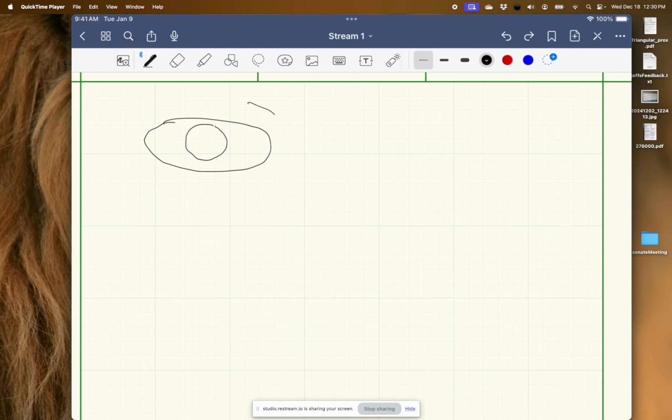There are going to be coils placed around this patient, and each of these coils is going to sense data from the patient from a disparate vantage point. So the patient we're going to represent as X. We're only going to be looking at a 2D slice. So X is a complex 2D array of size, let's say, m by n.